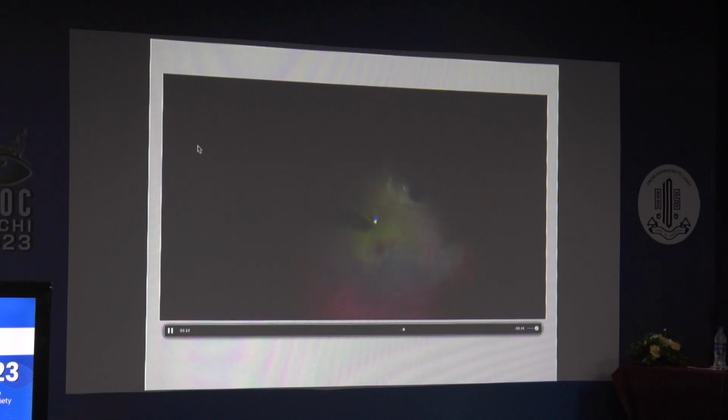This one had a lot of cystoid spaces, and the roof was very thin, so I was afraid that I would de-roof and cause a macular hole. So I did an inverted ILM peeling here and trimmed the stumps so as not to de-roof the fovea and cause a macular hole. The patient did fine in the post-op period.